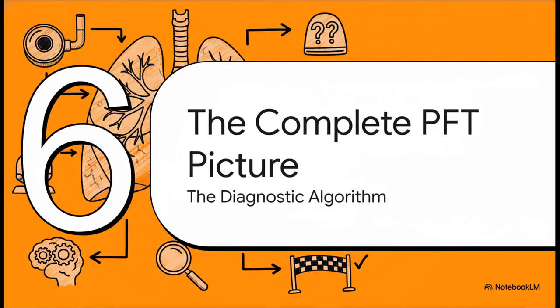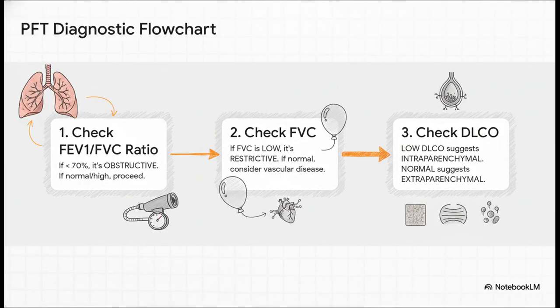Okay, let's put it all together now. We can synthesize everything we've talked about into a single, step-by-step diagnostic algorithm. This flowchart is really the key to systematically interpreting PFTs. So here's the entire process broken down.